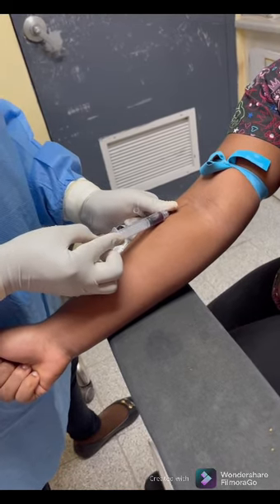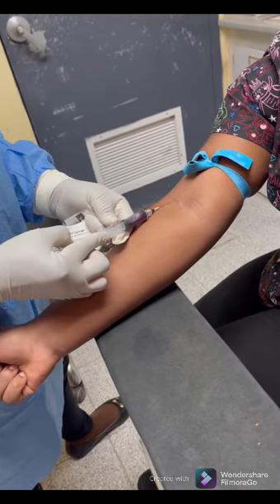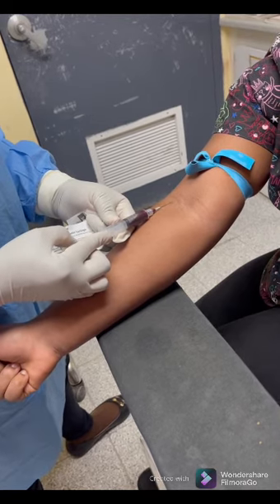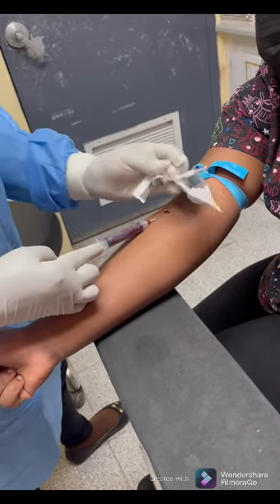Fill syringe, place gauze, remove needle, activate safety feature, and apply pressure. Discard needle, fill tube, and discard the syringe and transfer device.